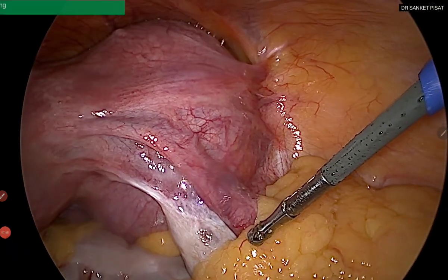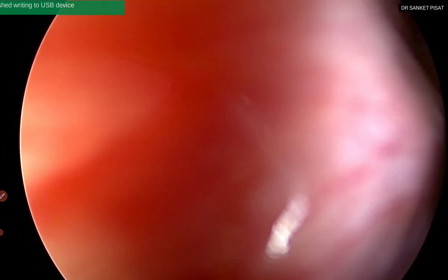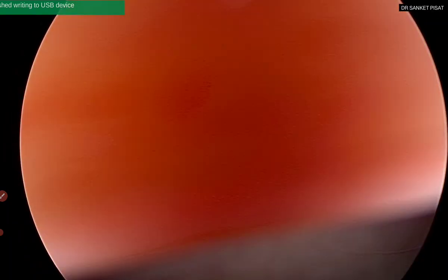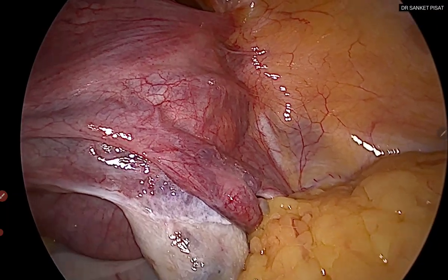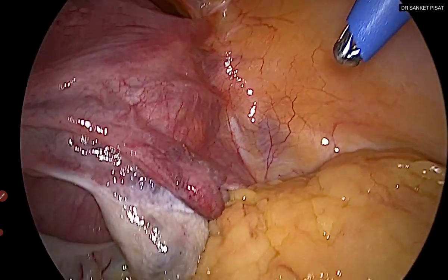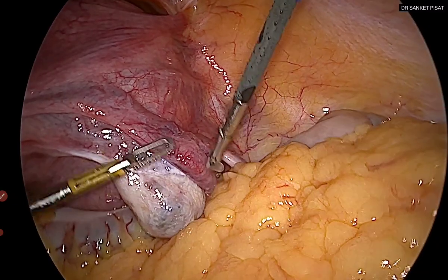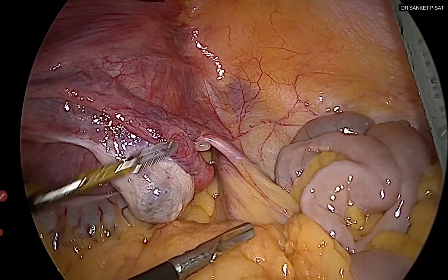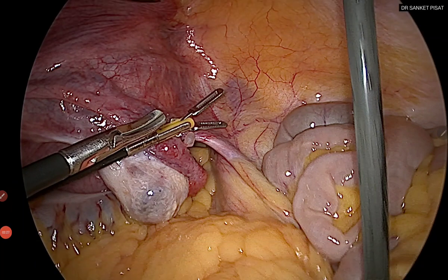This is the intraoperative picture. We can see a large broad ligament fibroid on the right side, almost completely occupying the right pelvic wall, with the uterus being deviated to the left side. The first problem in these scenarios is that one may not always be able to put a uterine manipulator inside. The second question is whether we would like to do uterine artery ligation in this case. Before answering that, it is worthwhile to spend two minutes planning the surgery.